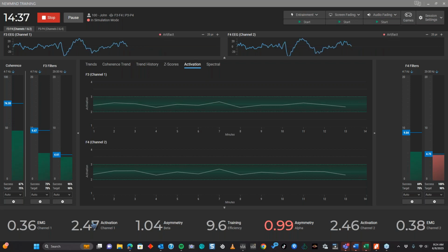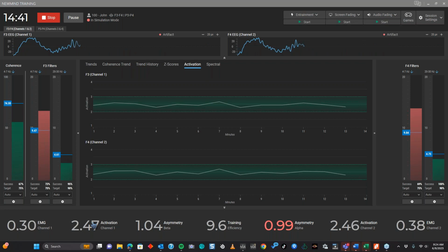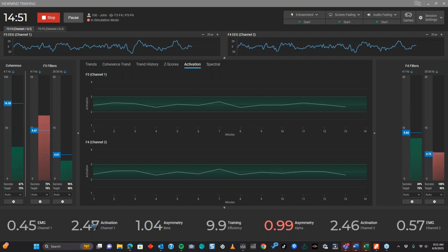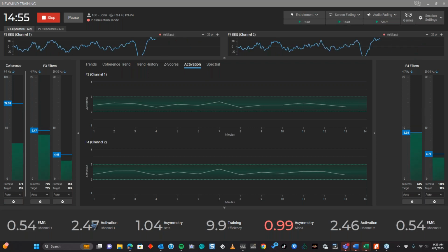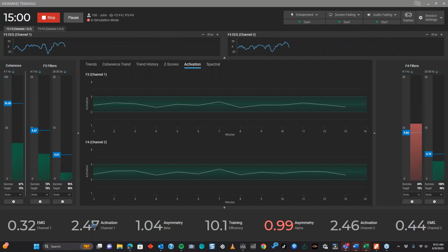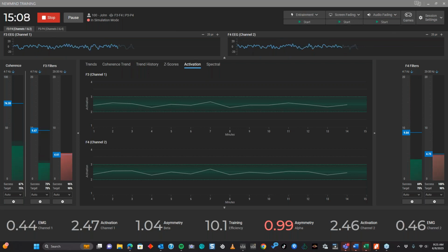Then I would say just go ahead with protocol 4, because the alpha is not as bad as the delta and theta, and by targeting those two slow waves, delta and theta, that will also help pull the alpha down even though you're not targeting it. That's another way to think about using that protocol. I've used it several times. If I'm looking at a map where everything is yellow and the alpha isn't terribly high, then go to protocol 4 and just use delta and theta.